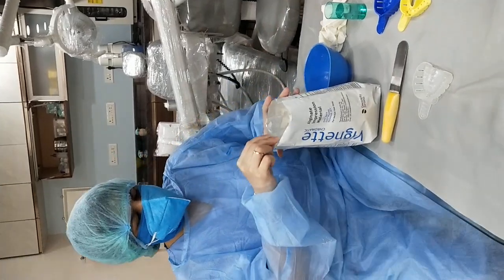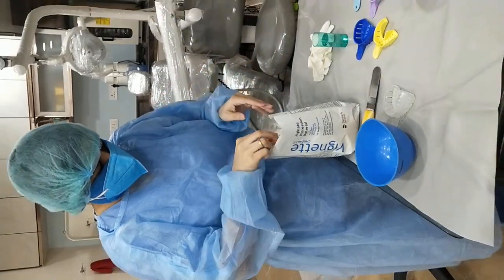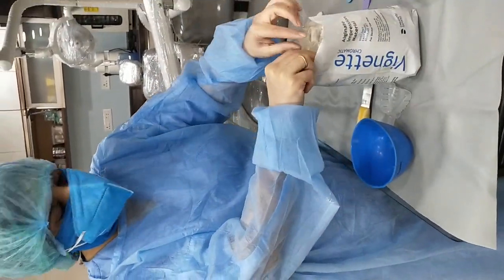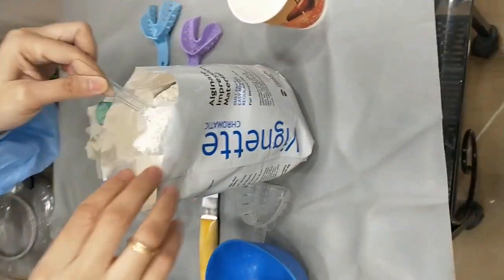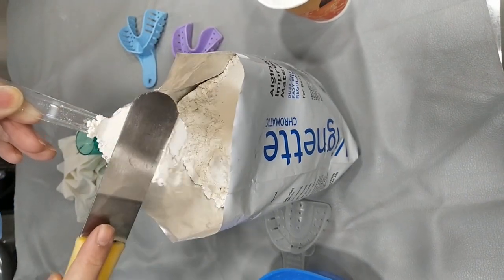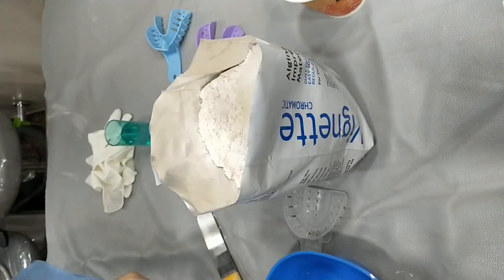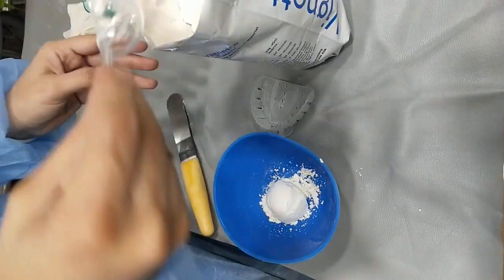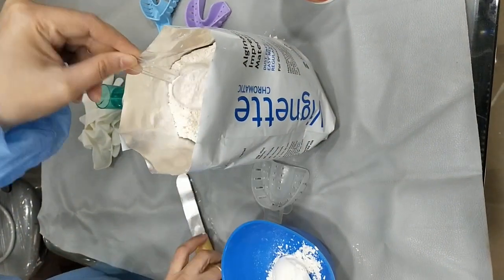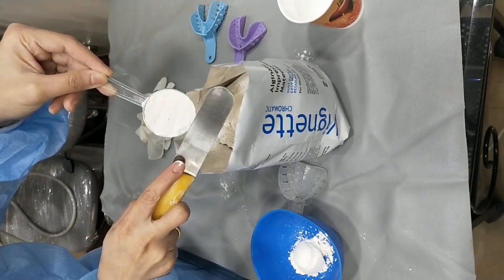So, taking a rubber bowl, draw up a scoop from the packet and flatten the heap with a spatula to avoid any air bubbles. After taking the powder, here you can see we have taken two scoops of the alginate impression material.